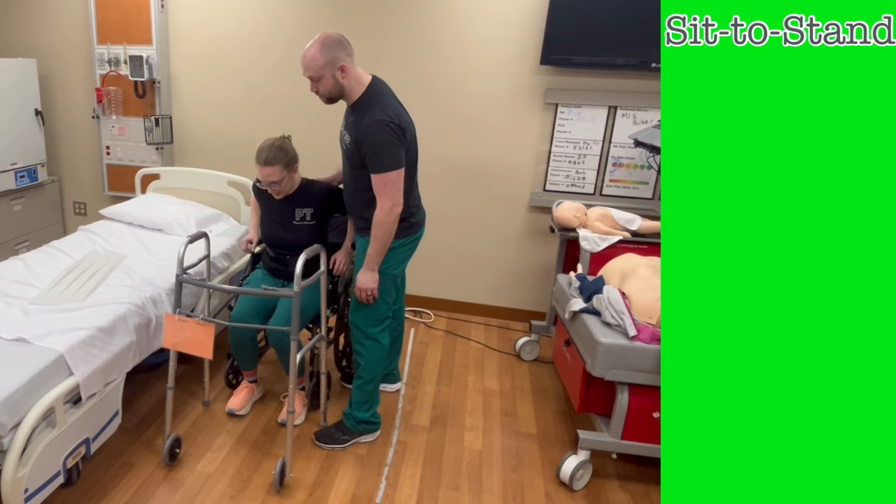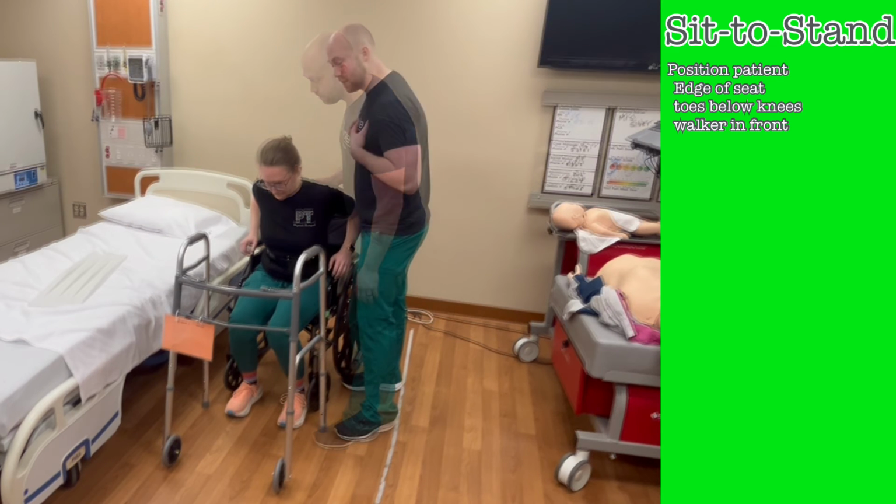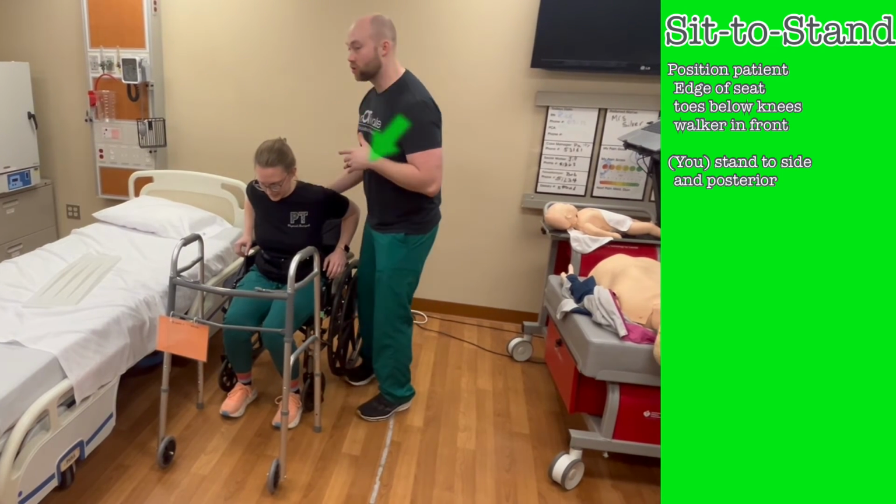Get the patient positioned the same as with the other techniques. Edge of the bed or seat, with toes below their knees or knees bent at 90 degrees. Have the walker in front of the patient and ready to be used, but never have the patient grab onto the walker before they stand. Position yourself to the side and posteriorly.